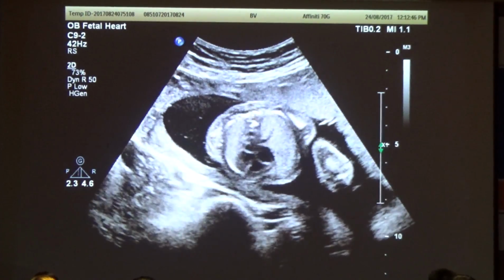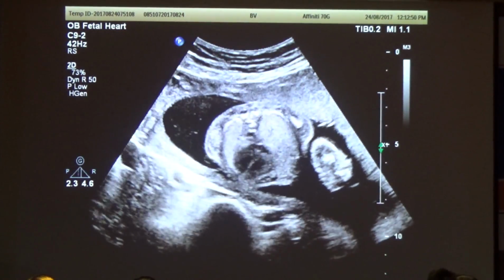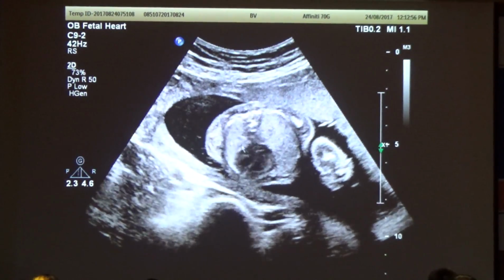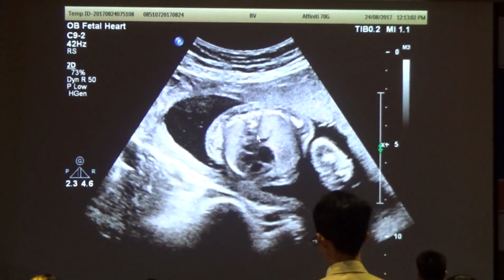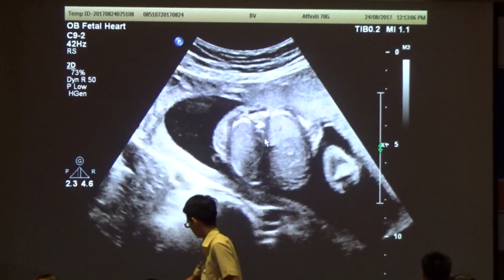Mình có cái hình này đây là có tim 4 vùng rồi đó. Do we have a pointer? I'm going to zoom in on this in a minute, but I just want to show you the spine. This is left side and right side. There's levocardia. Here's the sternum over here. So this is all the left side. Here are the pulmonary veins. Cái tĩnh mạch phổi đây.